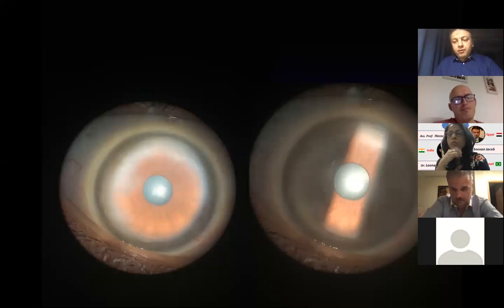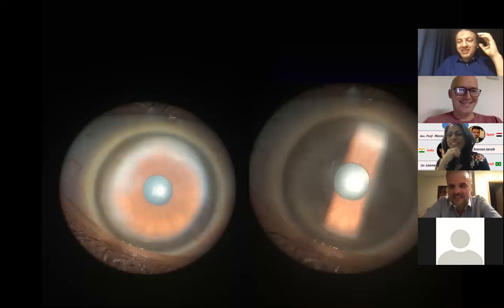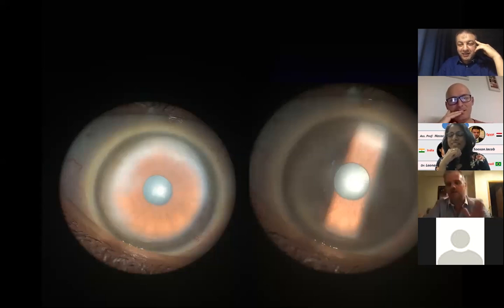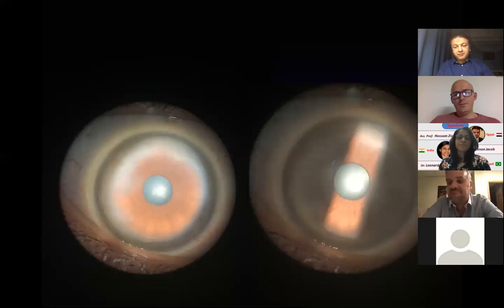I think it's time to break the suspense, Dr. Hossam. Just to make you alert, in this case OCT is very valuable, because we will do high scans on the cornea to see if there is anything inside that cannot be seen on slit lamp. Maybe we'll find some opacities or something.